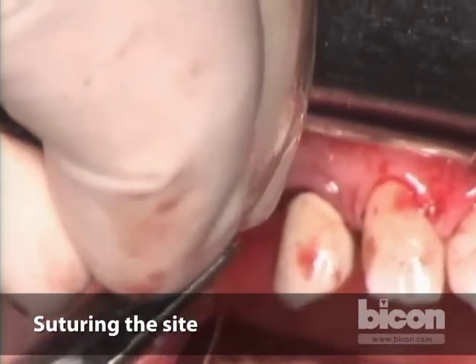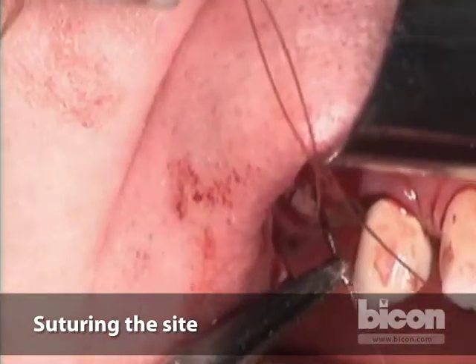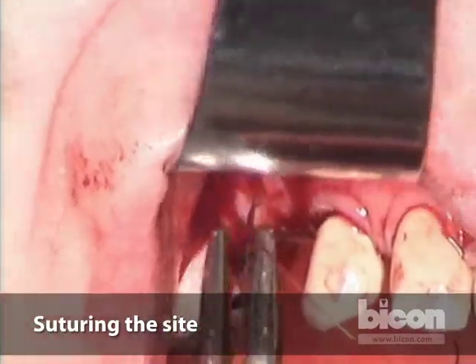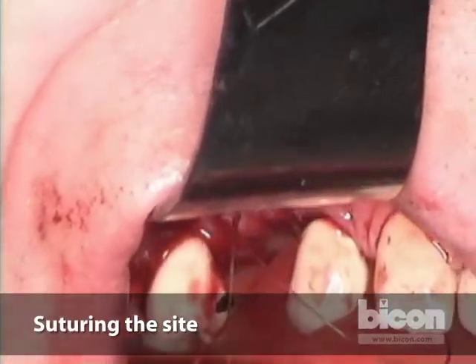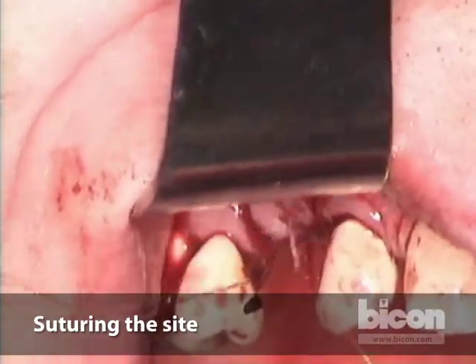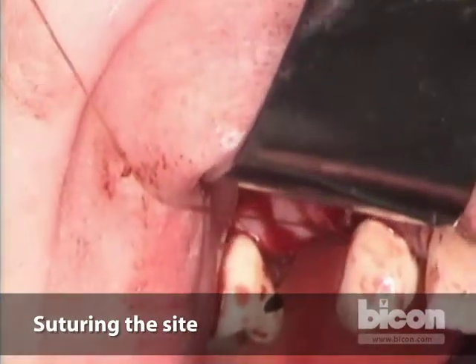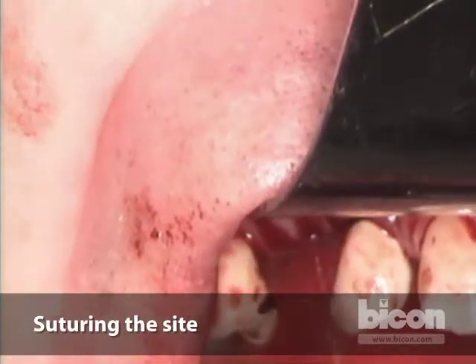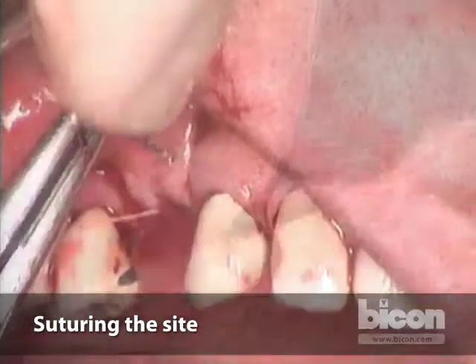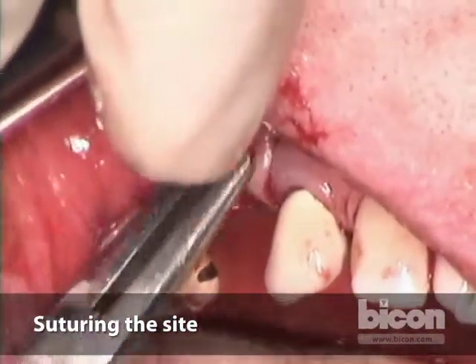Here's one. It's important to have all of these suture ends uncrossed. Okay, don't pull, Jim. Good. That's it. So this is the main suture that will hold everything at the crest. And now we'll reapproximate the releasing incision. First things first. Again, you feel that at all? A little bit.